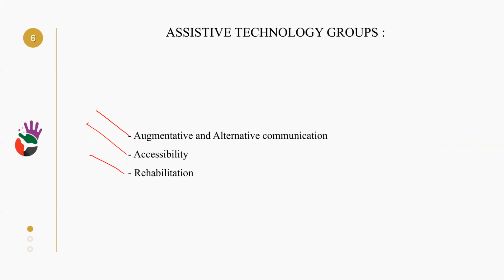Accessibility can involve different devices, and our decision will be affected by the motor or sensory issue that the child has. For example, many of them have low tone, so they don't have muscle strength. So most probably they cannot use the scissor. So maybe we can go to a scissor operated by battery.